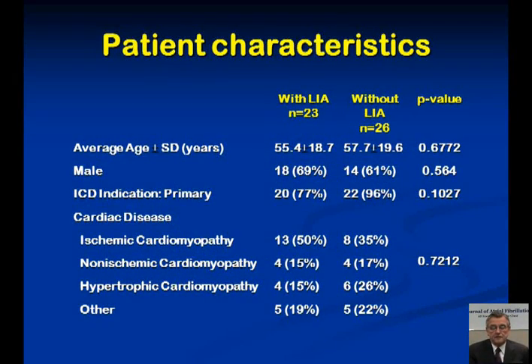The average age of patients with the LIA and without the LIA are shown. There was no significant difference. There was no significant difference in gender or the ICD indication. There were no differences in the underlying cardiac disease.